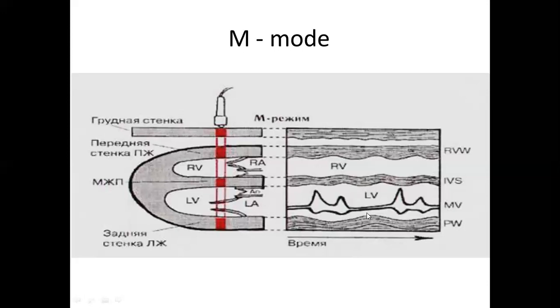So here, actually, we are having systole of the left ventricle. So all the blood, and by the movement of the ventricle and septum, you can even see how the cavity is becoming a little bit narrow again, because this is systole.